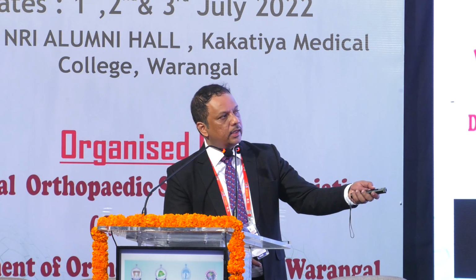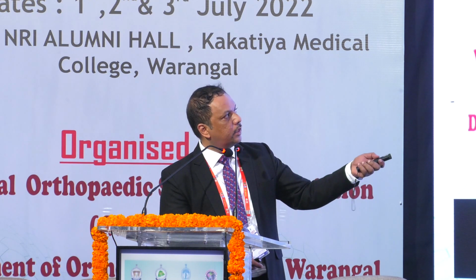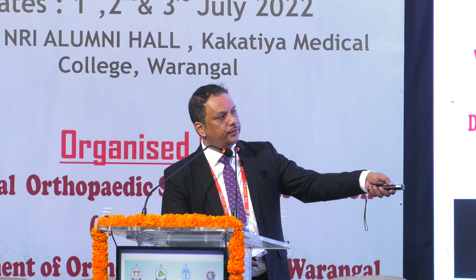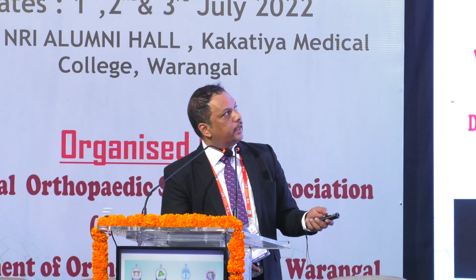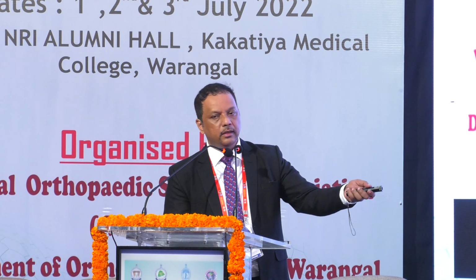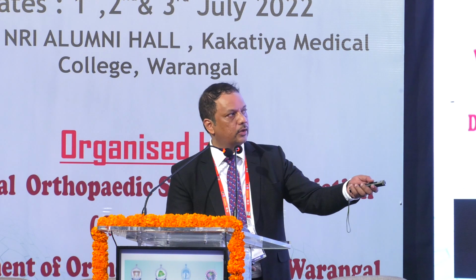Volar lip or depressed fractures, right? You can use your levers or osteotomes. I've used a punch here actually at this point to go all the way. It's an intrafocal kind of thing. So you have to push those fragments gently up to get the articular surface back, and then you would get the reduction. A lot of times you see this radial displacement. The culprit here is the brachioradialis always.